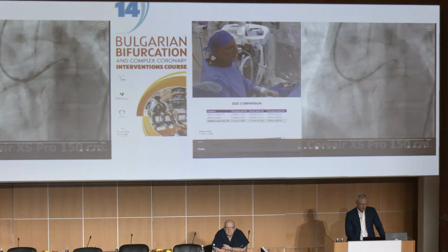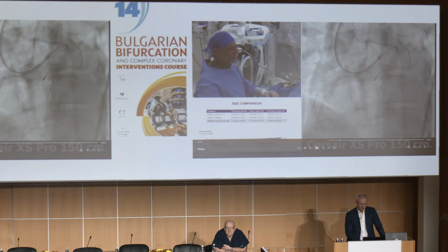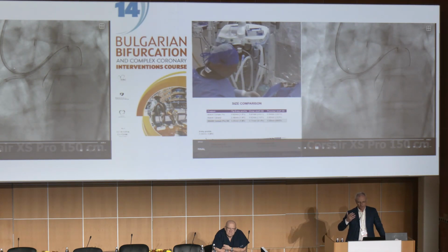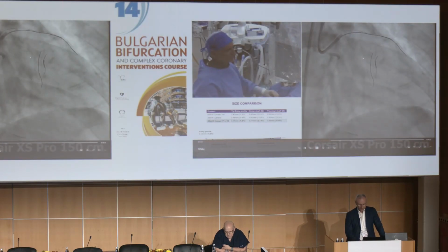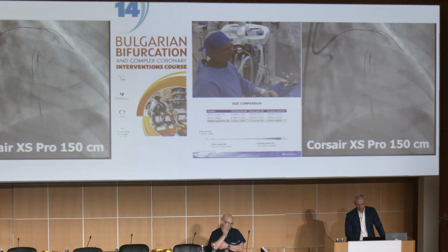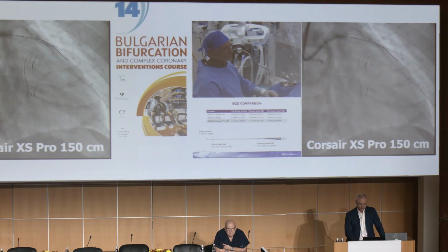And on that respect, the next step to do, you see how we do. This is a catheter that makes a trapping. And we reinsert now a different microcatheter. This marker here is a wire because when you want to move out devices that are 150 centimeters long, then you have to trap it in order to remove them over a wire that is 180. So the third microcatheter in the way. So all of these are showing the evolutions of how things are going on. It's a contemporary practice. How do you react to a problem?